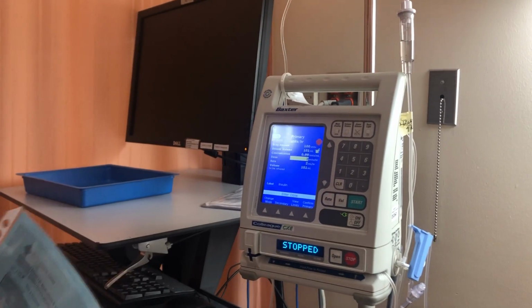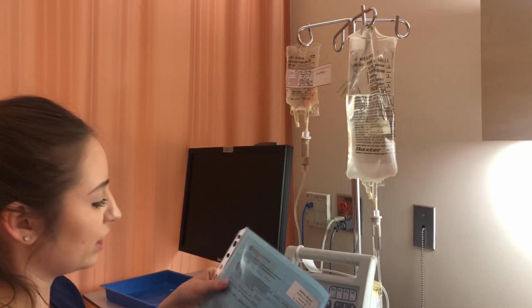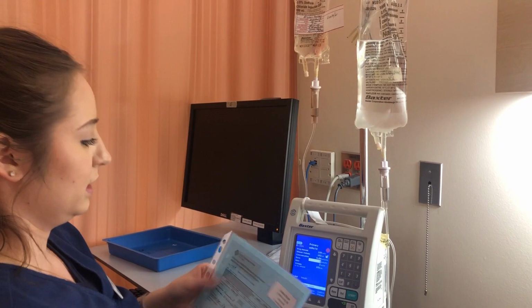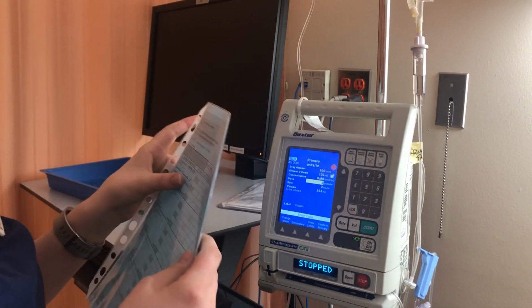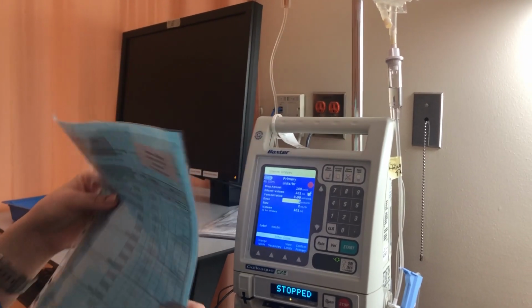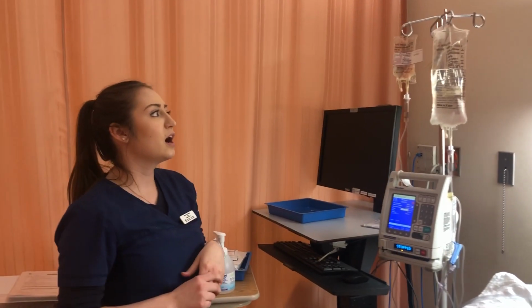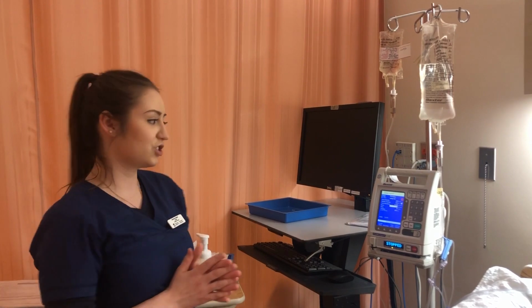So right patient is Bryson Scotlan, and I'm just looking at the armband again, Bryson Scotlan. Comparing it to the mini bag, Bryson Scotlan. The right drug is Insulin Humulin R, and this is insulin right there. Continuous IV is the correct route. Right dose is 2 units per hour, which is on my label here, and it's also correctly inputted into the pump. And the right time is now. So I would get another nurse to come do an independent second check for me. She would go through all the same things that I just did so that we're on the same page.